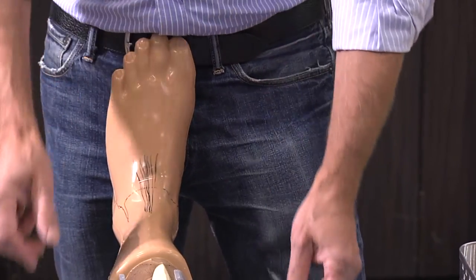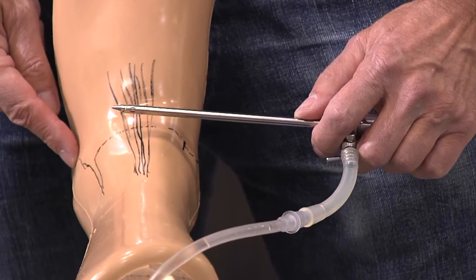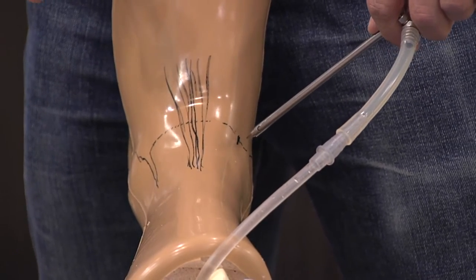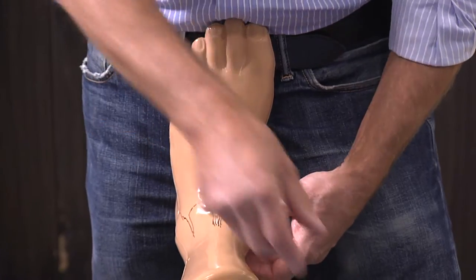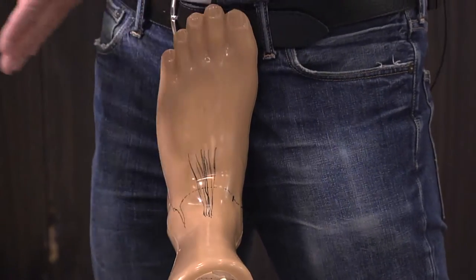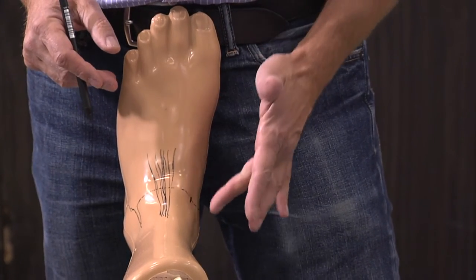If your portal is too medial and your scope is in, you will never be able to look at the tip of the lateral malleolus. If the scope is more central in the joint, you can look at the lateral malleolus. Try to make the medial portal as central as possible by dorsiflexing — the anterior tibial tendon moves to the center of the joint, and then you go just medial from it. That's where you make your incision. On this model it's not easy because the tendon doesn't move.